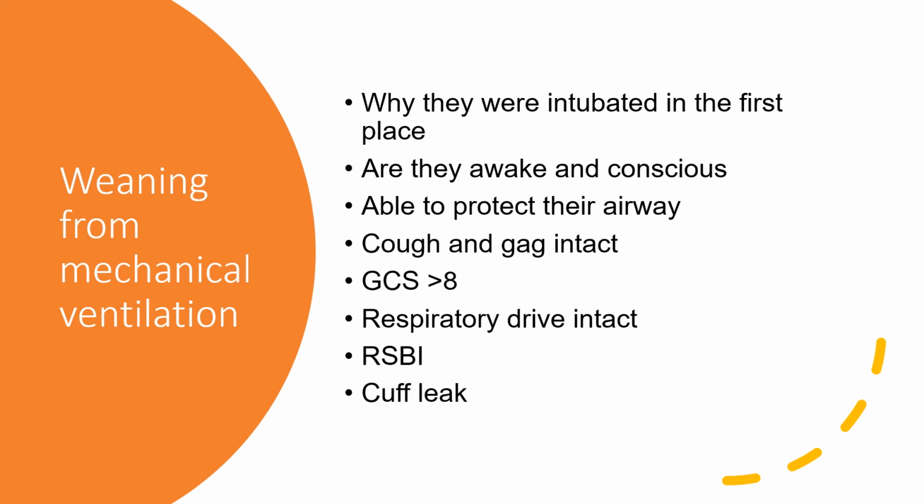So this is a one slide picture of what to do from a mechanical ventilation point of view, weaning them from it. First of all, you have to ask yourself, why were they intubated in the first place? If the underlying condition that required them to be intubated is resolved, for example, suppose they had pneumonia, suppose they had ARDS, suppose they had surgery, whatever the case is, if they were intubated to protect the airway and maintain it for a certain period of time, did they recover from that illness? Did they get better? Are they ready to come off the ventilator? Basically, they have to be completely resolved of any kind of condition.